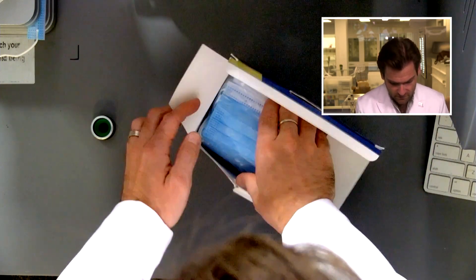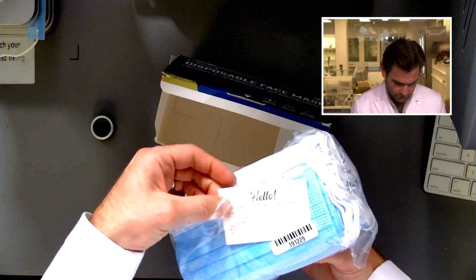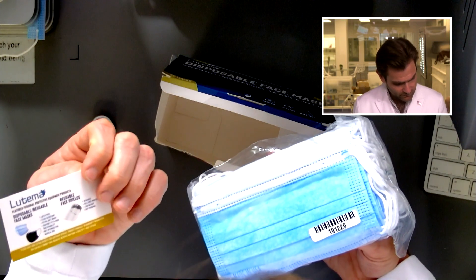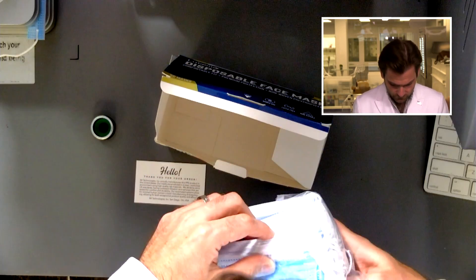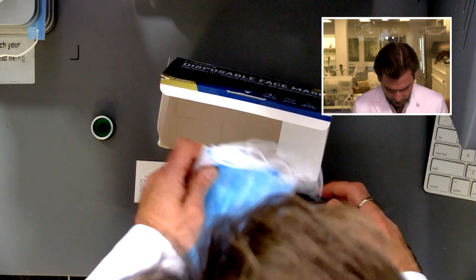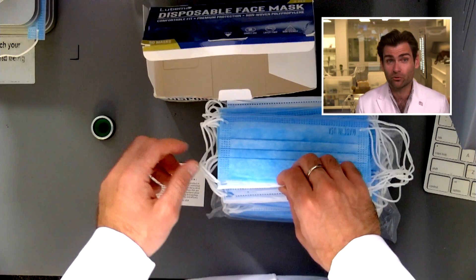These guys started manufacturing at the top of the pandemic. Look at this — 'Hello, thank you for your order.' That's so nice. They've got the lot number right there, which is great for traceability. They're not making any claims on the box about what kind of filtration they offer, though they do have some ASTM level three masks you can buy on Amazon — these are not them.